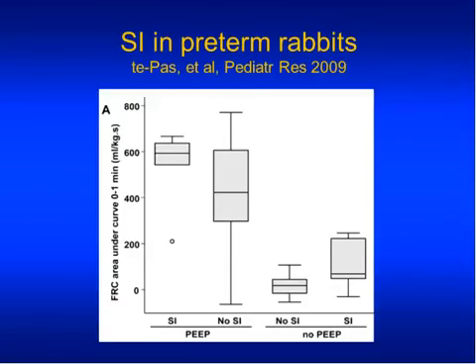This slide points out the benefits of various measures to help establish FRC. On the right, 2 columns indicate, I'm sorry, something's popping up on the screen, indicate that with no PEEP, whether you use a sustained inflation or not, there is not very good aeration of the lungs.